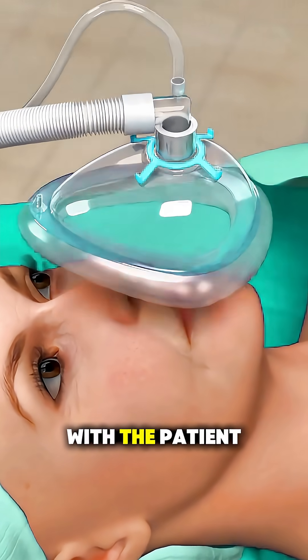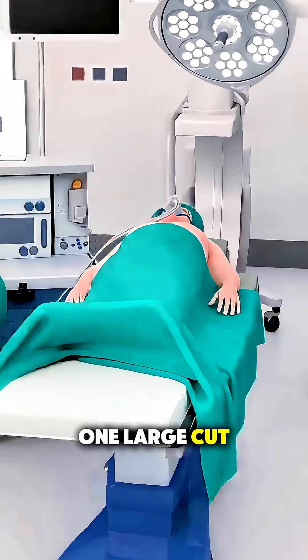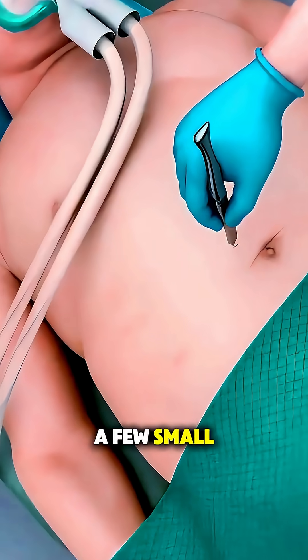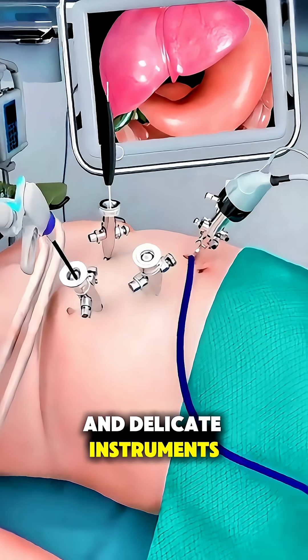It all starts with the patient under general anesthesia, and instead of one large cut, the surgeon uses a few small incisions to guide a tiny camera and delicate instruments inside the abdomen.